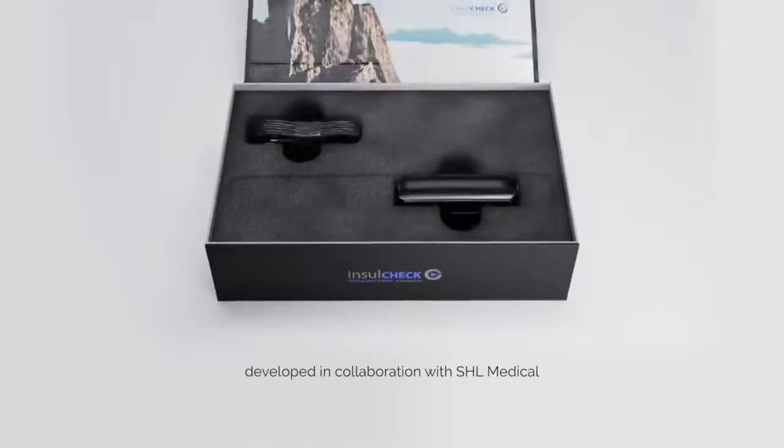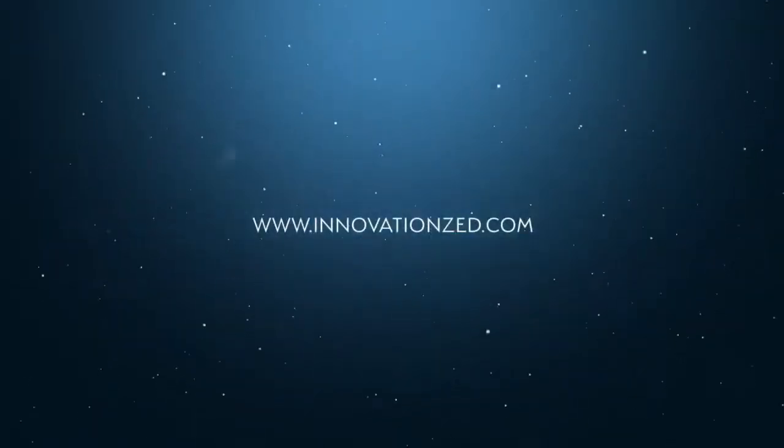Developed in collaboration with SHL Medical. Contact us now to learn more.